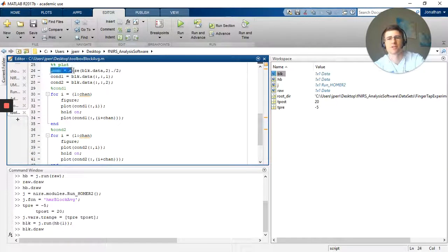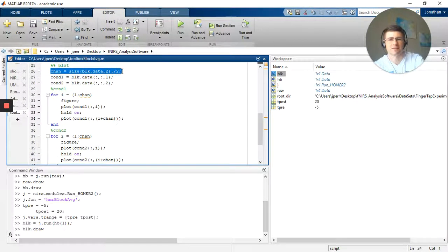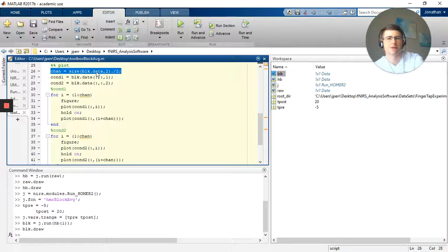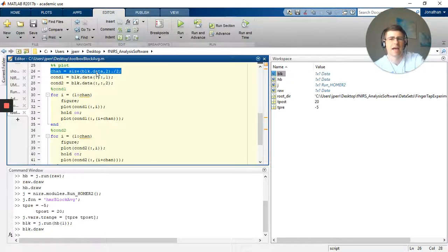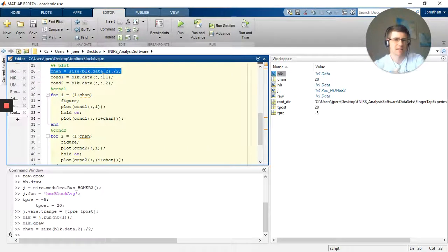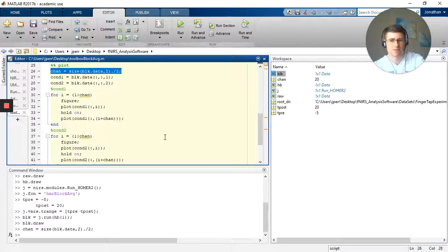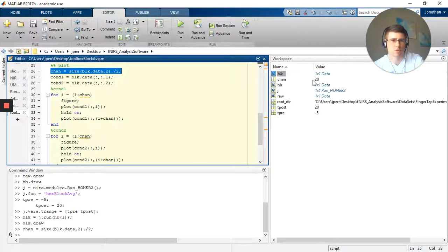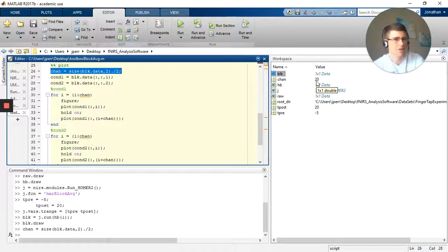So let's go through this. First things first, I want to figure out how many channels I have. Well I'm going to take the whole second dimension of the data set and I'm going to divide it by two, because I happen to know it's oxy and deoxy, so there's two dimensions on that. Well look, channels now is 20. I had 20 channels, and I happen to know I did have 20 channels.